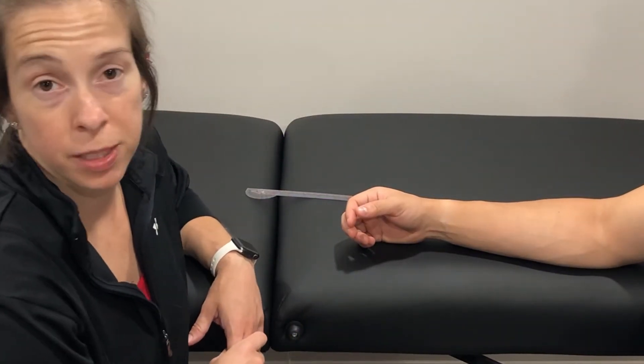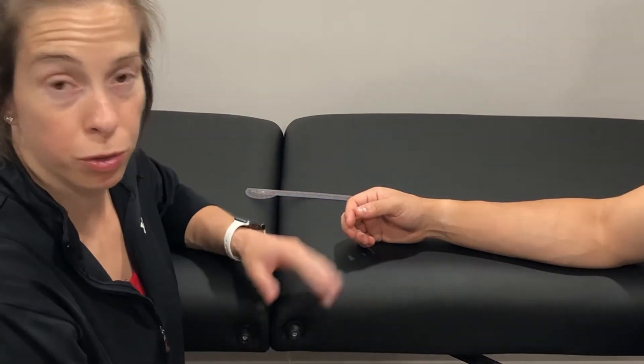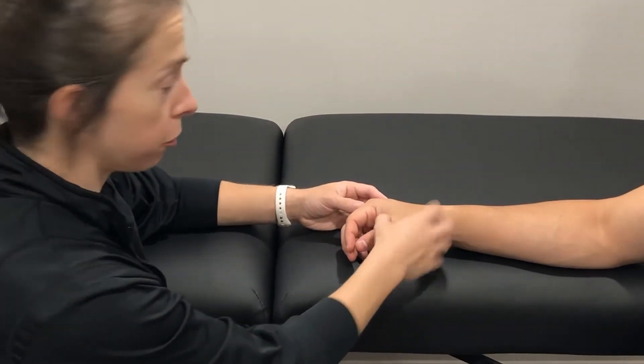Measuring flexion of the MCP joint. Patient is seated, arm is resting on the table. Checking passive range of motion first.